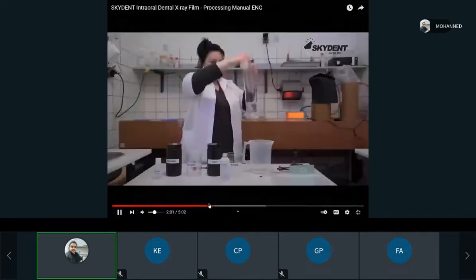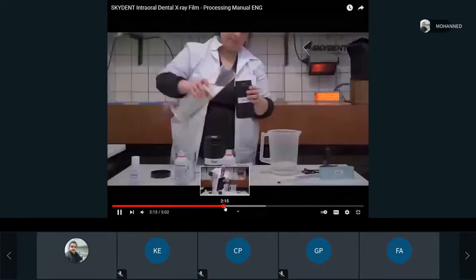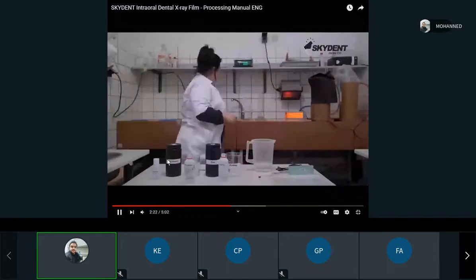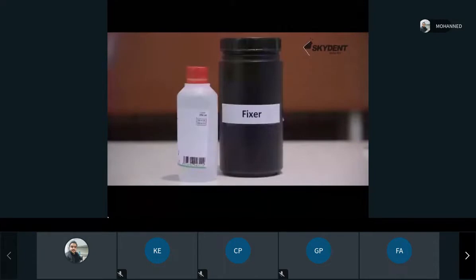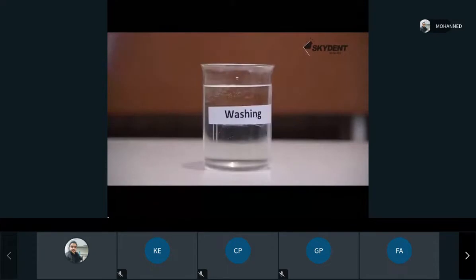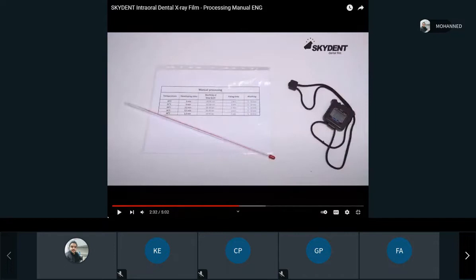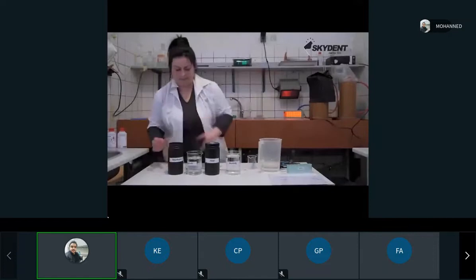Anyway, she prepares these to avoid confusion. Let's see, and she put them in these containers that have fixer and developer. Always follow the instructions exactly on the packing. I mean, technically, it has to be in red lights, you know.